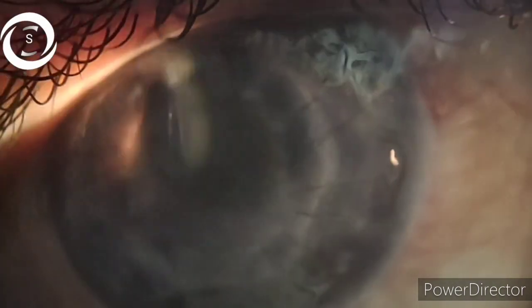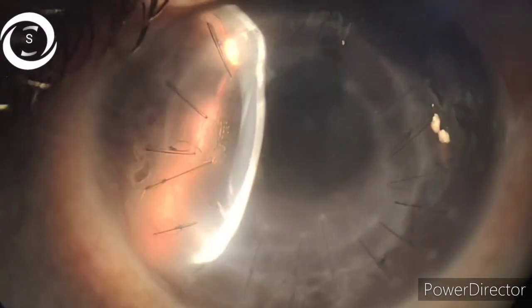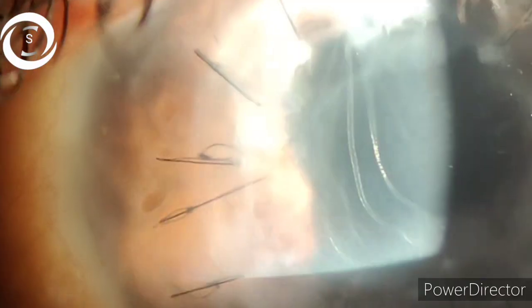The second patient has pseudophakic bullous keratopathy, for which penetrating keratoplasty was done. Finding tight sutures in one or multiple areas after penetrating keratoplasty is a common finding. Here again you can see these vertical lines going in a circular fashion around the cornea.